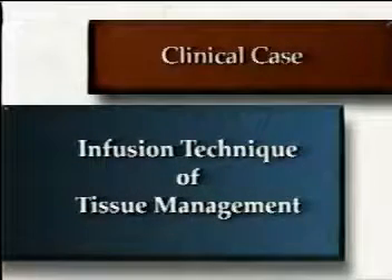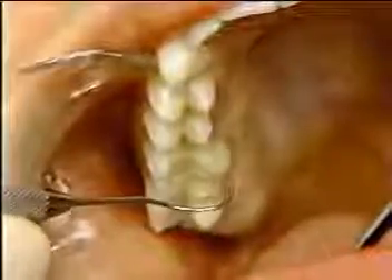Let's follow a clinical case for the infusion technique of tissue management prior to taking an impression. A functional bonded core has been placed previously in this tooth.